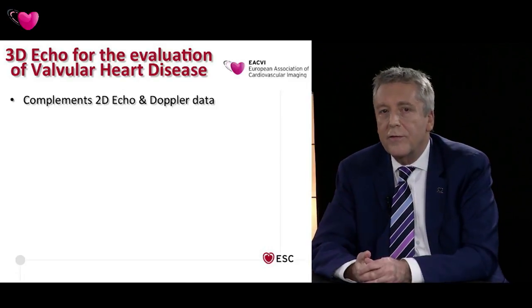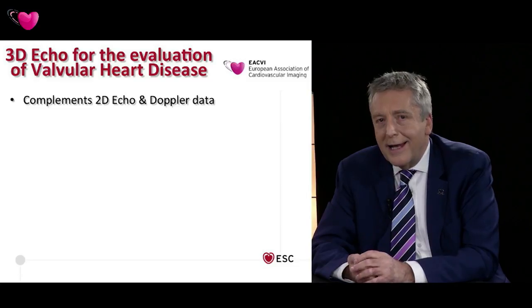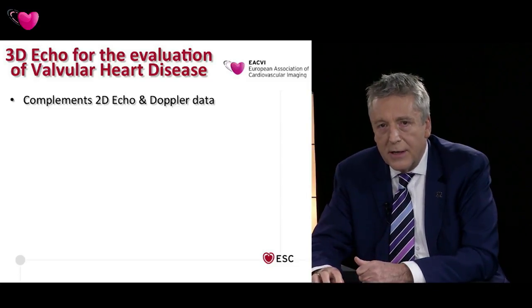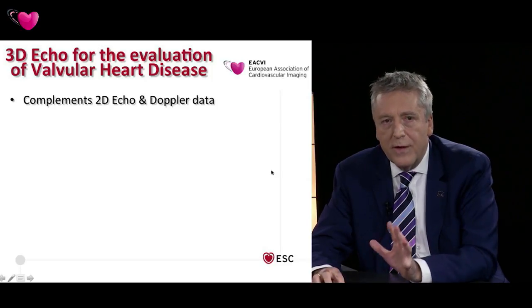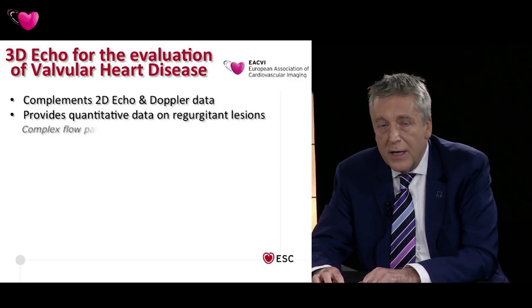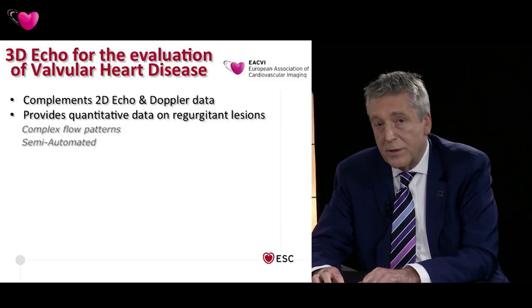So just to conclude now, in terms of 3D echo evaluation for valvular heart disease, although I talked exclusively about 3D echo here, clearly it is a complementary technique to our standard 2D echo and Doppler data, and of course they form part of every investigation as well. But it does provide us with additional quantitative data on regurgitant lesions, as I've shown you, particularly in patients with complex flow patterns. And it can be semi-automated, just as it can be for the LV as well.